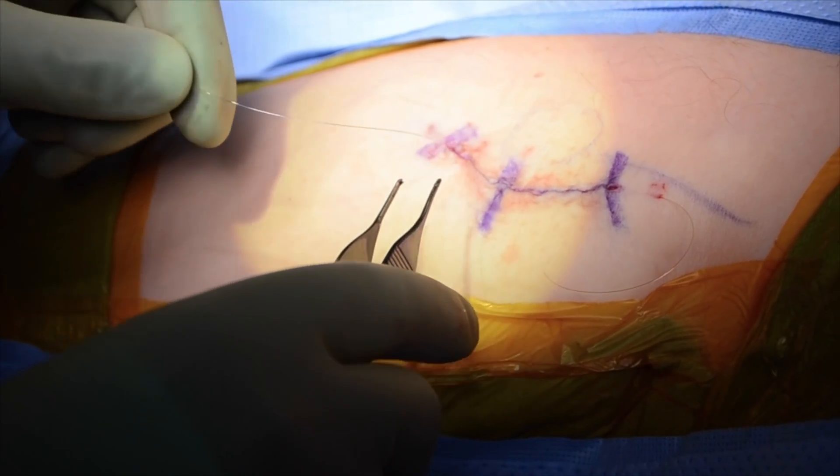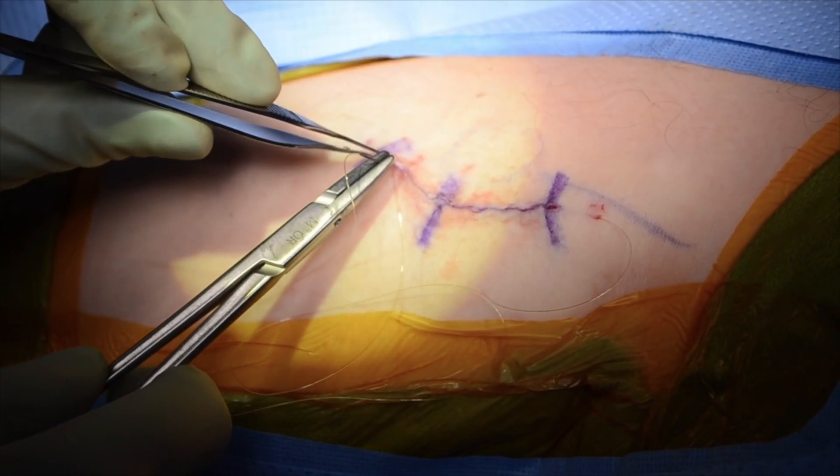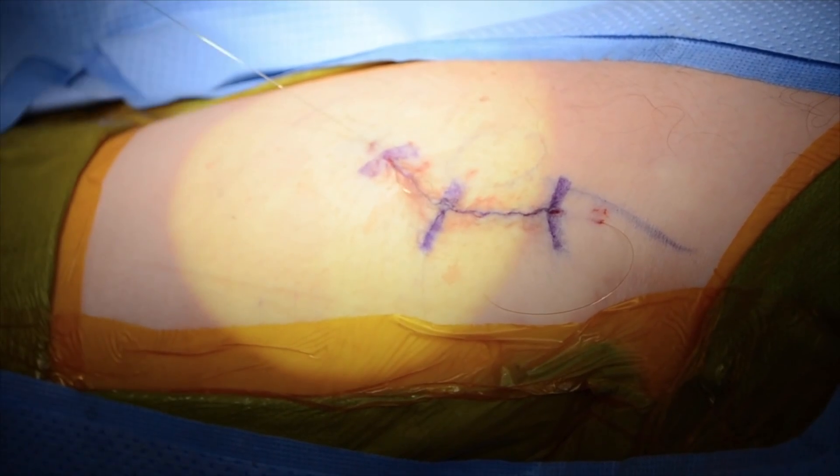The incision is then covered with Steri-Strips, Curlex, and an ACE wrap. No bracing is required and the patient is allowed to bear weight immediately.